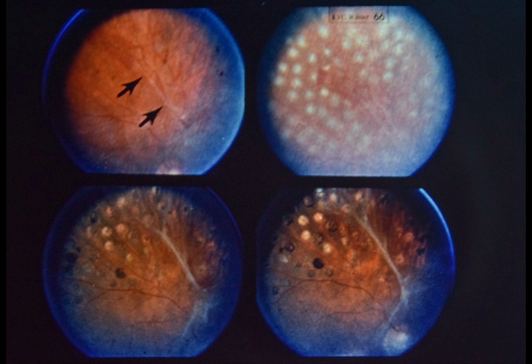The use of scatter argon laser photocoagulation in Eales disease is still considered experimental. It was performed in this case in an effort to reduce the frequency of recurrent vitreal hemorrhages. The rationale for scatter photocoagulation is to obliterate areas of retinal non-perfusion which theoretically elaborate a neovascularization producing substance.